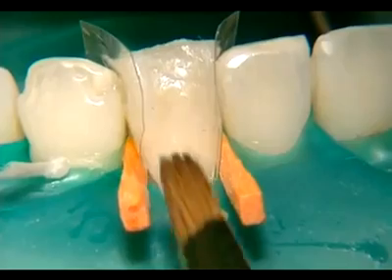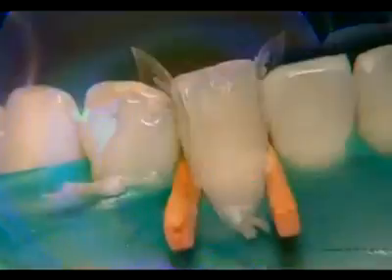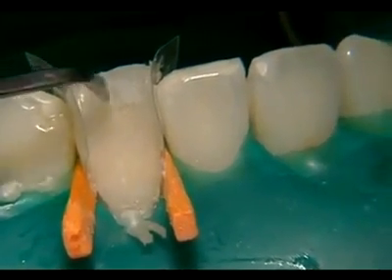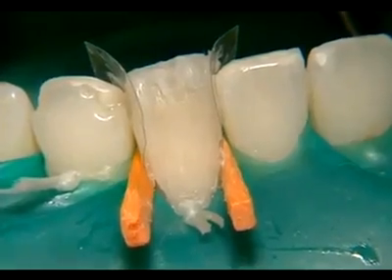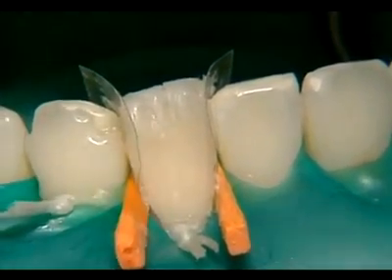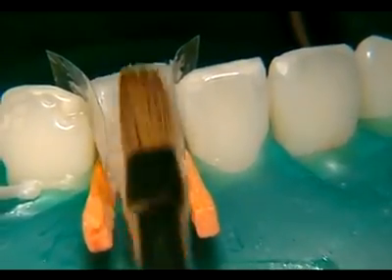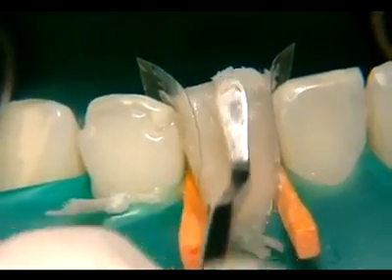The transitional areas are easily smoothed over with a brush. Then the material is polymerized again. Vertical, wedge-shaped increments are applied to the central area of the incisor using clear enamel material. To complete the layering procedure, a small portion of the enamel material selected is applied to the facial area and adapted.